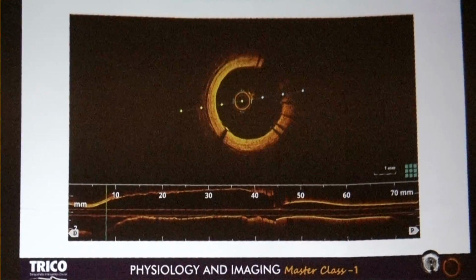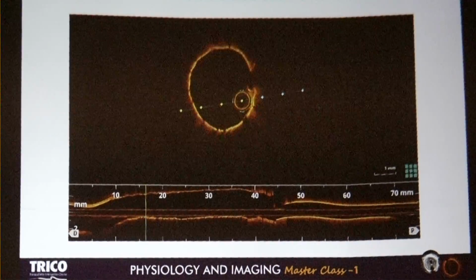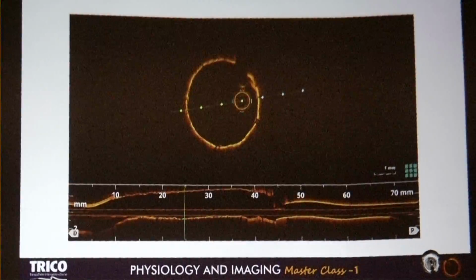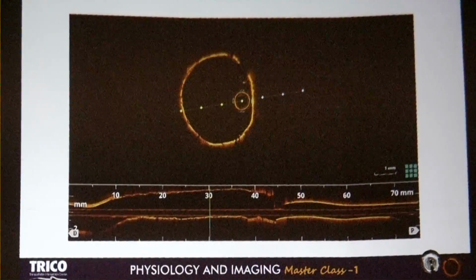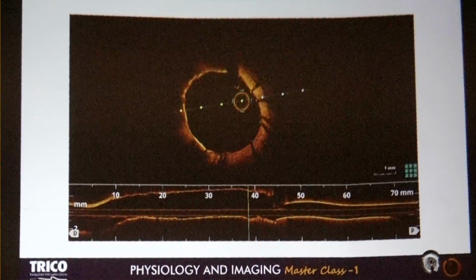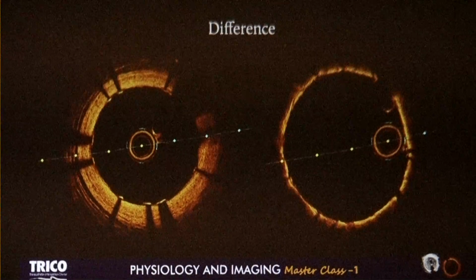This is a normal stented segment, and there it's a full moon eclipse type of picture, and this is all red thrombus all around. Red thrombus, and then again the normal area where the stent was extended. Now, this was the difference.